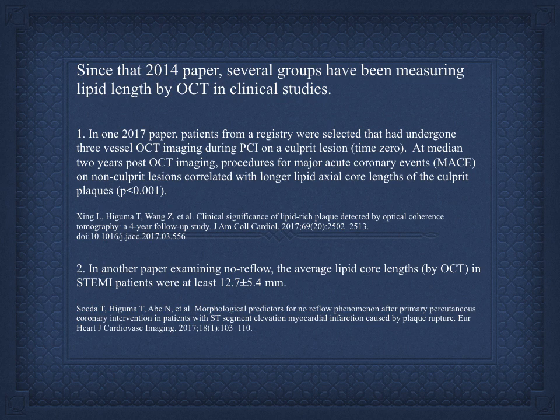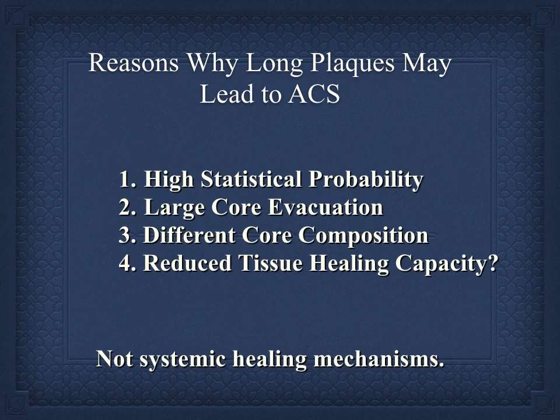Now, in another important study in the Journal of Cardiovascular Imaging, they were looking at no-reflow with OCT, and that part isn't what we're going to discuss here, but if you looked at the two groups, no reflow versus normal flow distally, these were all patients that had an MI. The core length in these STEMI patients was greater on average than 12 millimeters, which is extremely long and consistent with our hypothesis.